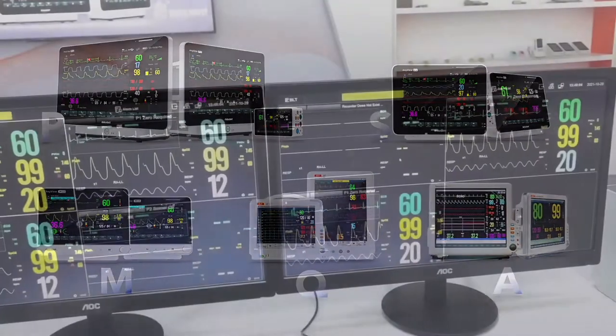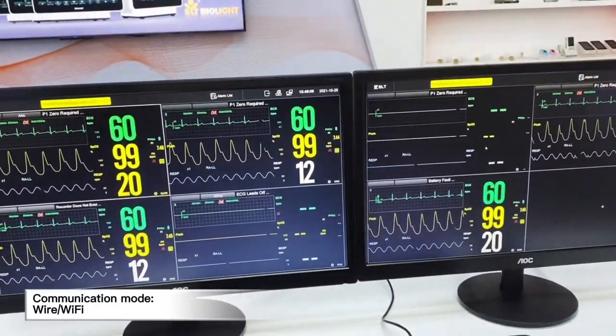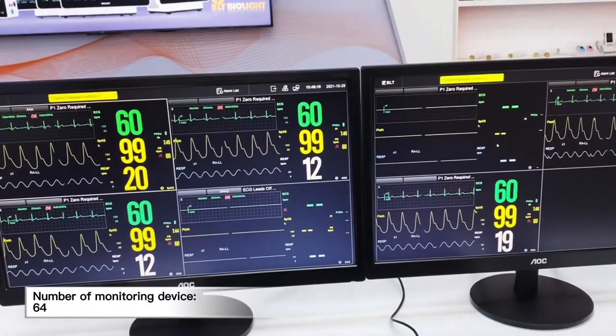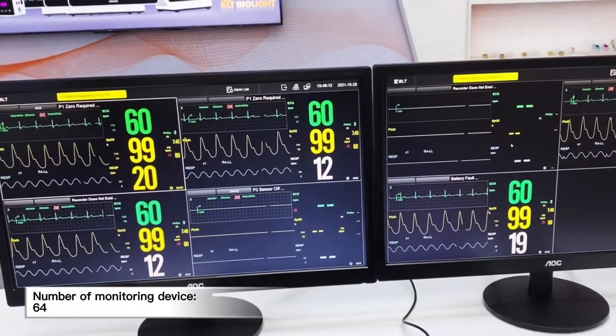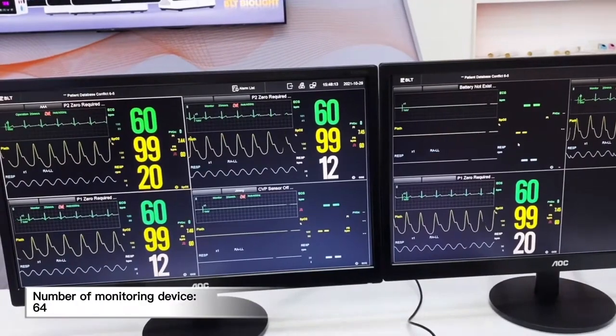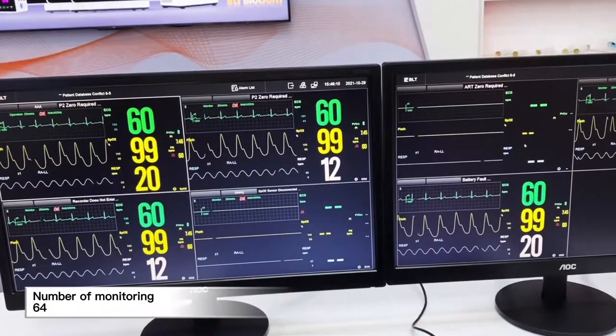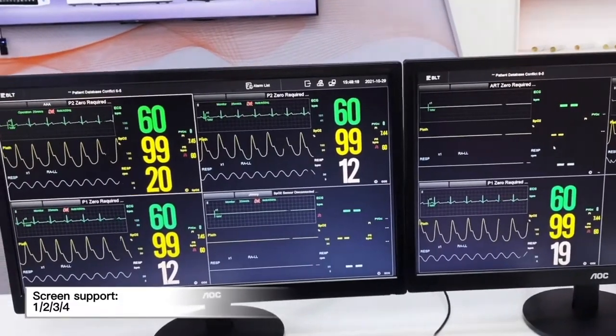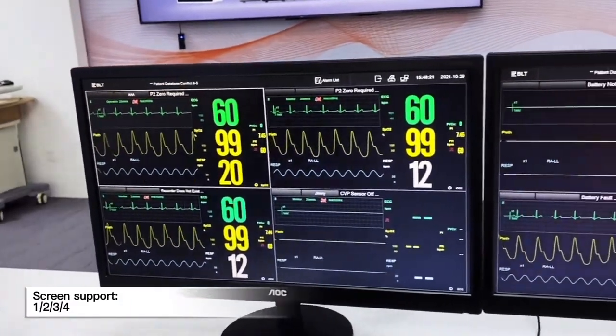BioVision supports the brand new P-series patient monitor, S-series patient monitor, M-series, A-series, and Q-series. The communication mode includes wired and Wi-Fi. The number of monitoring devices is up to 64 devices being monitored at the same time. Screens support one screen, dual screen, three screens, or four screens.